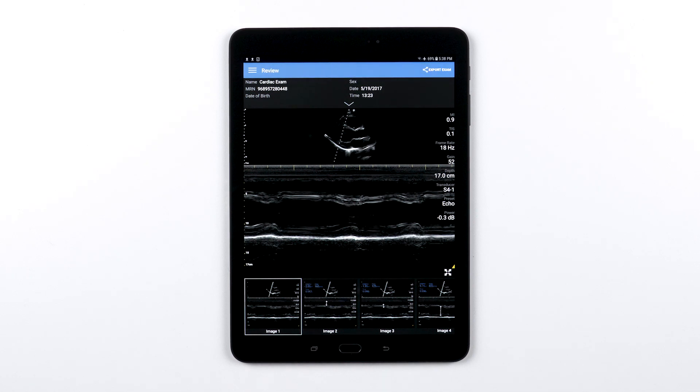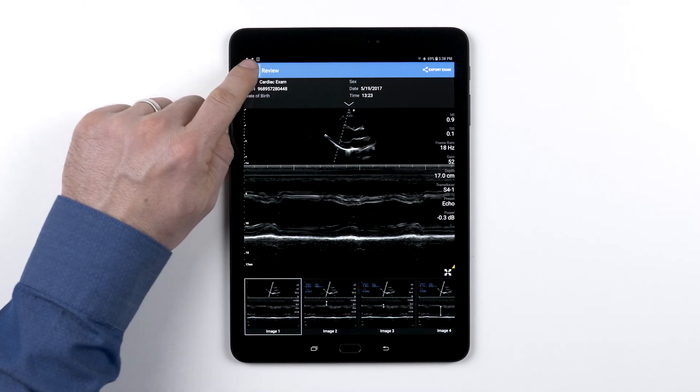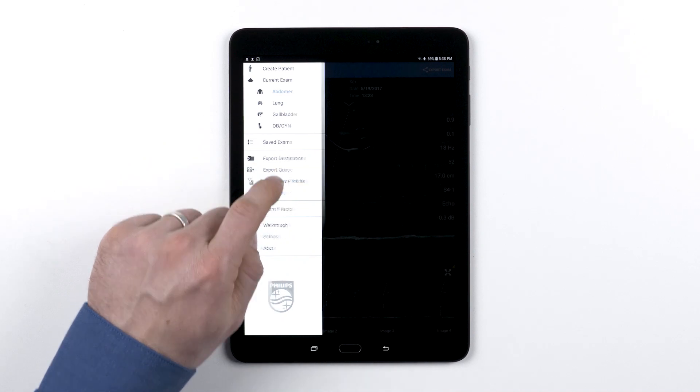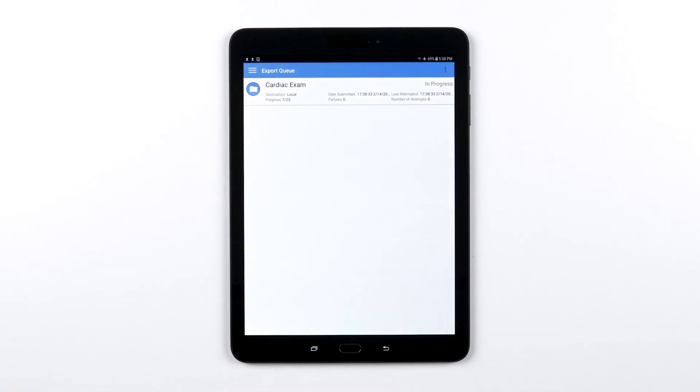To see the status of your export jobs, you can tap the menu and select the export queue. This may be helpful if you have multiple exams exporting at the same time.